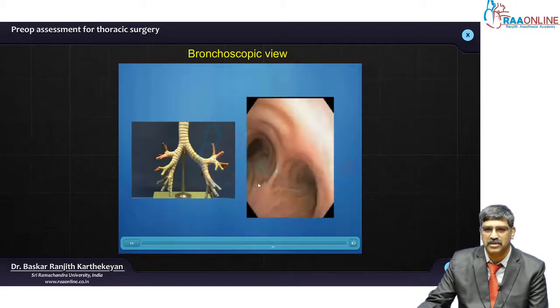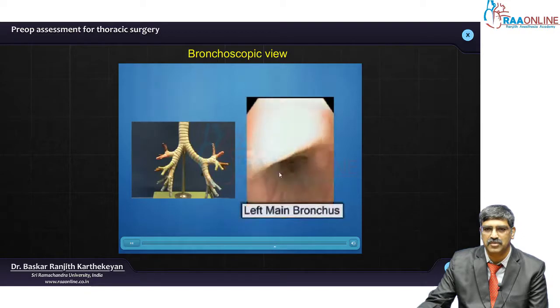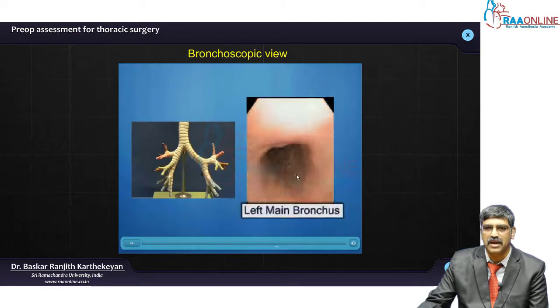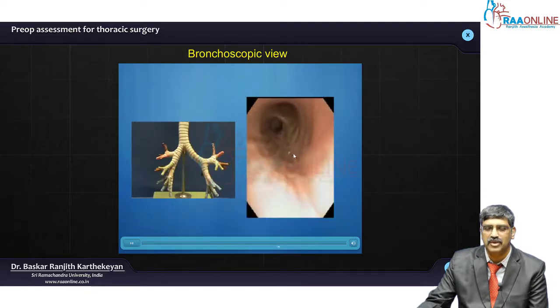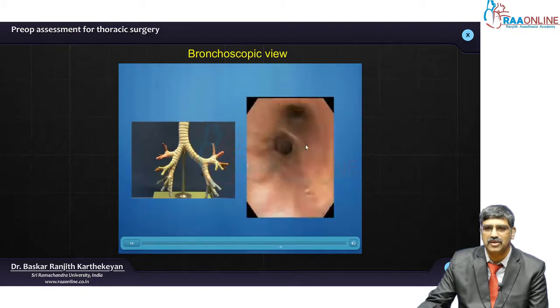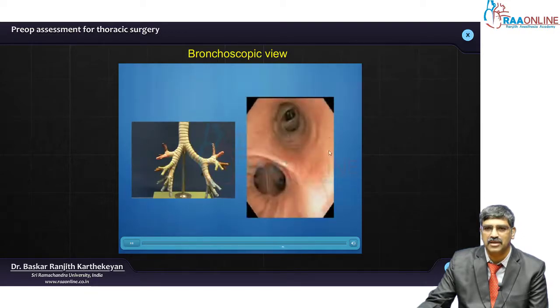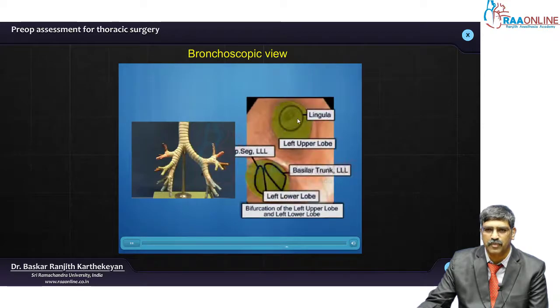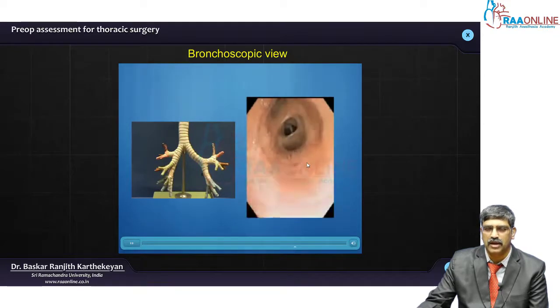Here is the left main stem bronchus. As you enter in, you can see 2 segments: the upper lobe along with the lingula, and the lower lobe.